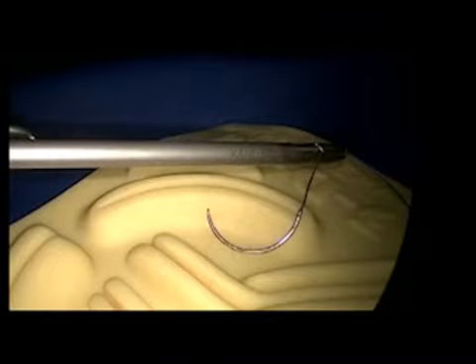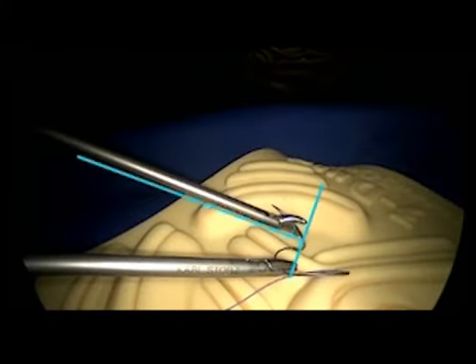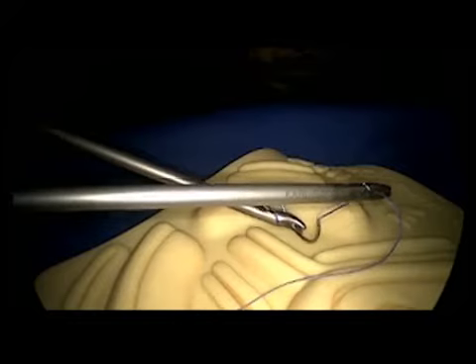For explanation purposes, we have three named points, A, B, and C. The needle is introduced with the needle driver at point A. Next, drag the needle until the assistant grasper is perpendicular to point B. The needle is righted by moving the suture with the needle driver.